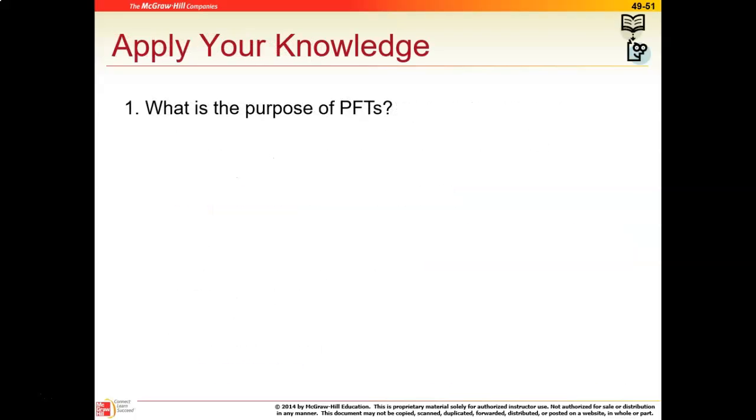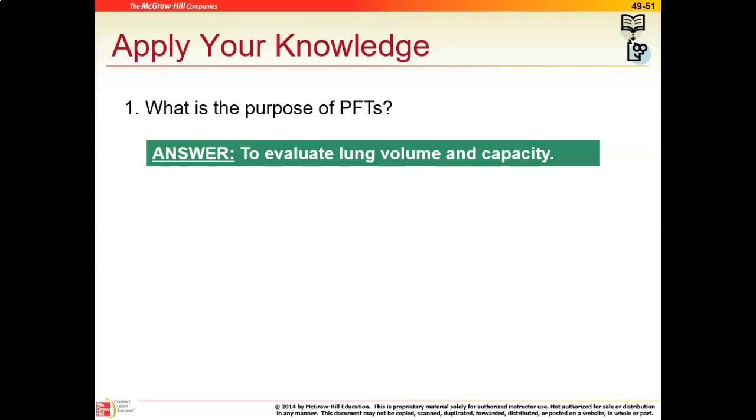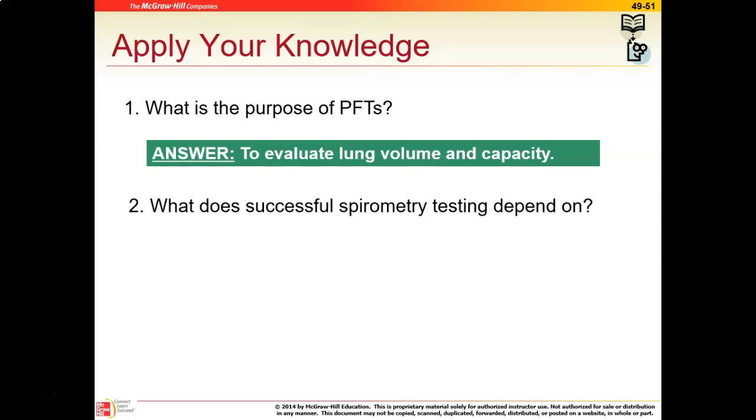All right, so a couple of questions. What is the purpose of pulmonary function testing? So the purpose, as we talked about in that first slide, is to evaluate lung volume and to evaluate lung capacity. And we can do that by doing spirometry. We can do that by doing peak flow values with a peak flow meter. We can also add to that the pulse ox, and that can give us an idea of how that person is respiratory wise and oxygen saturation wise.